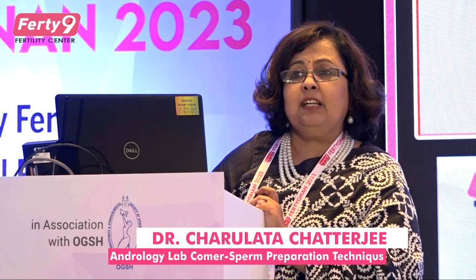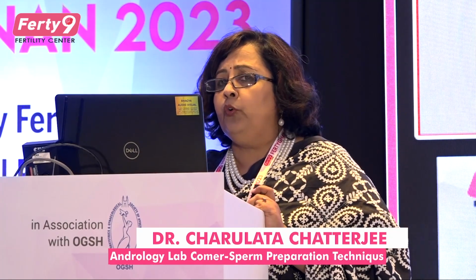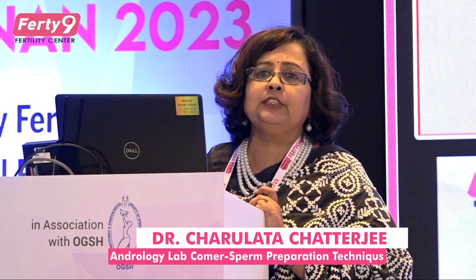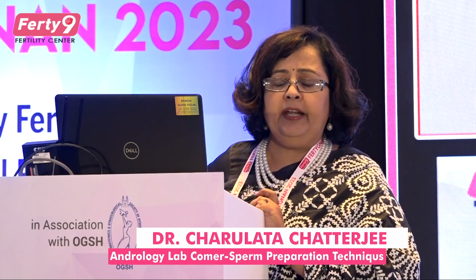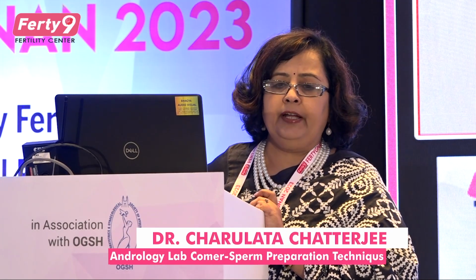Now, the basic sperm preparation methods, some which are most popular and some which are not. One of the oldest methods to prepare the sperm is the glass wool technique. In this, motile spermatozoa are separated from the immotile by means of densely packed glass fiber wool.